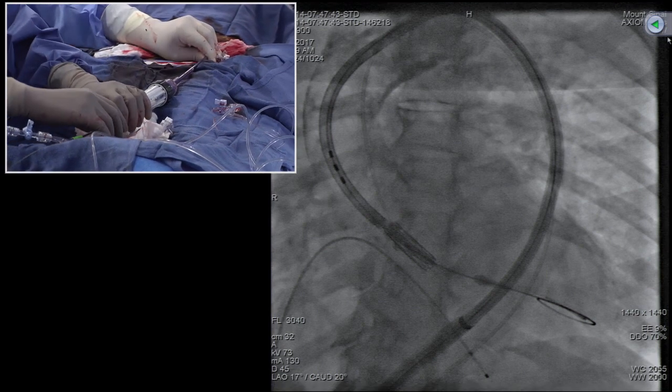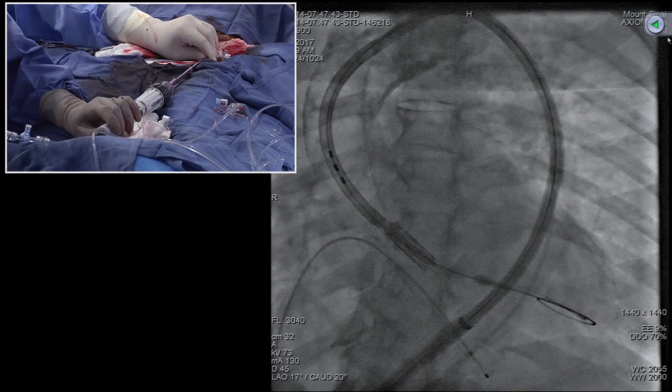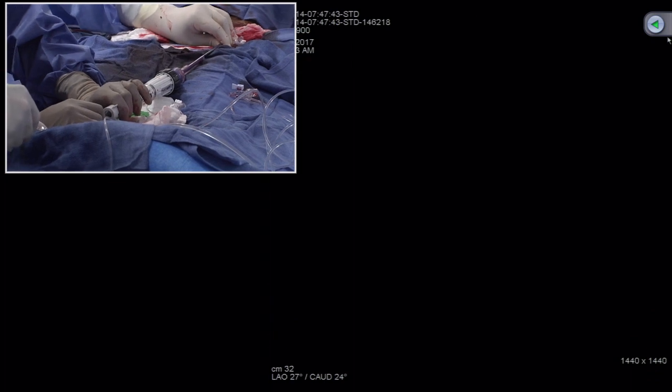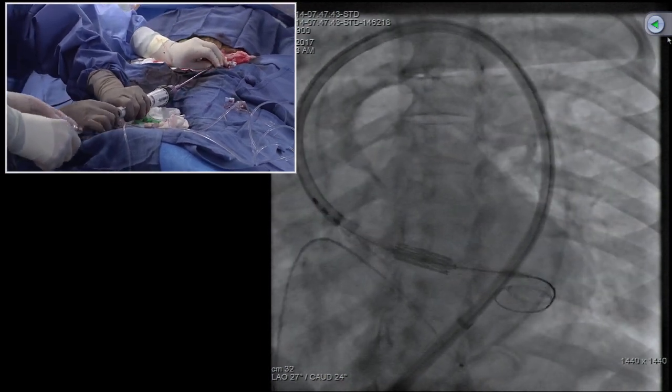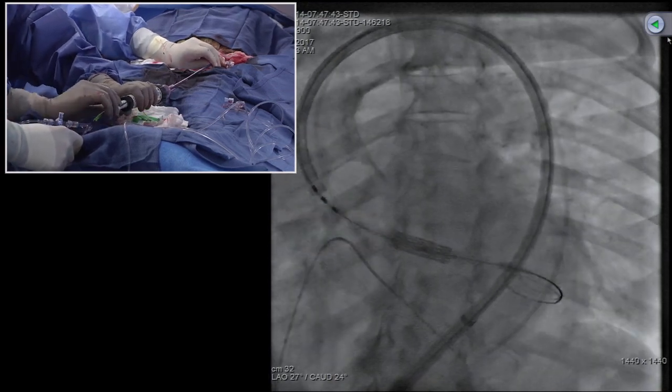Very important. Now you can bring the valve in position. You have to unlock and then bring the flex catheter back. This is how you do that. Don't forget to flex catheter back so the balloon is exposed. One more action. Nice. All right, so very good, the lock.